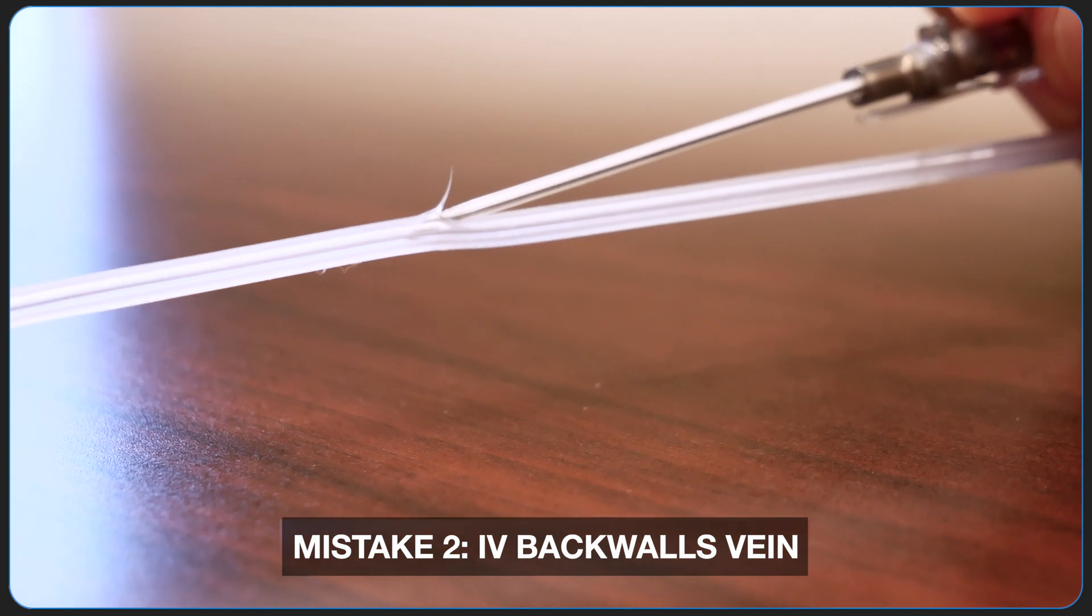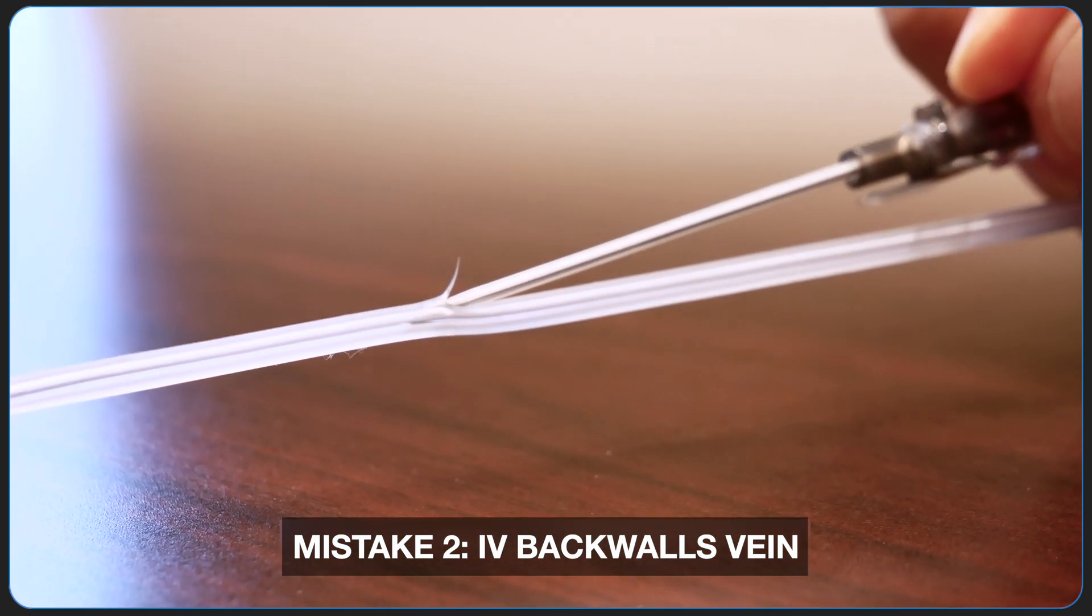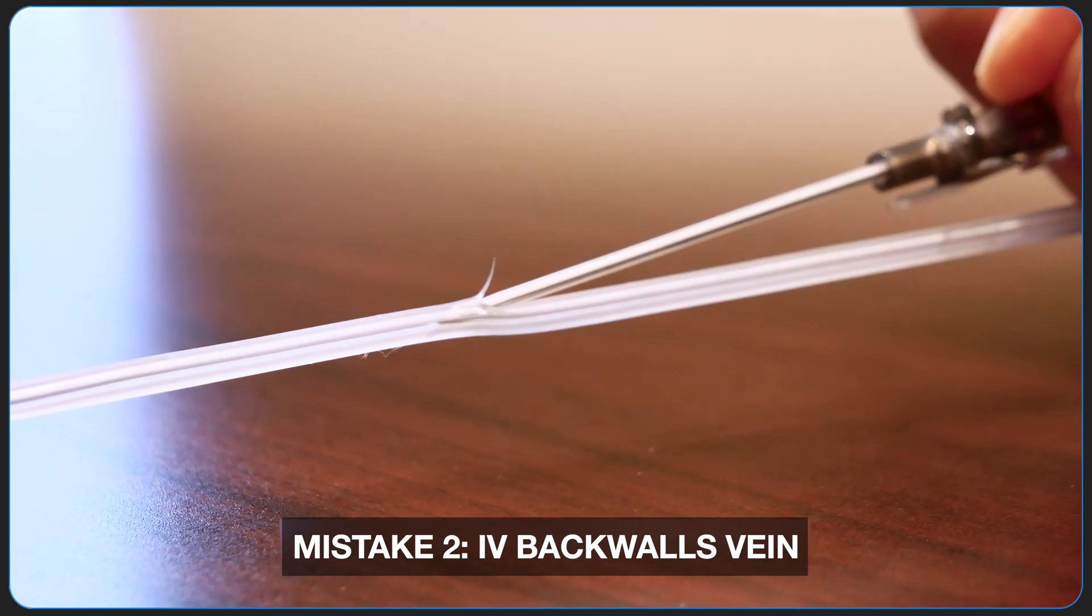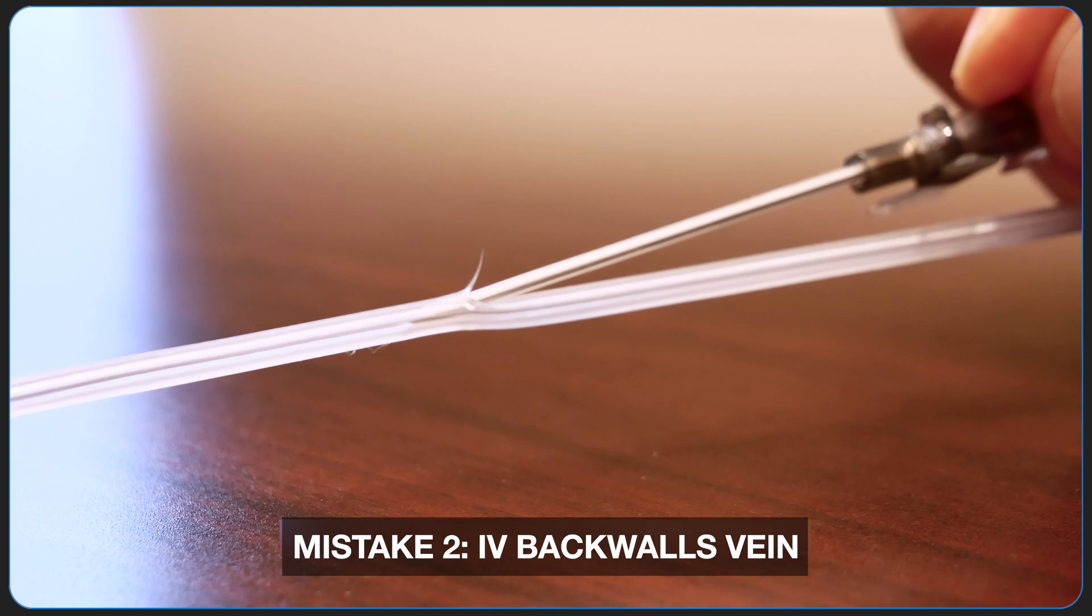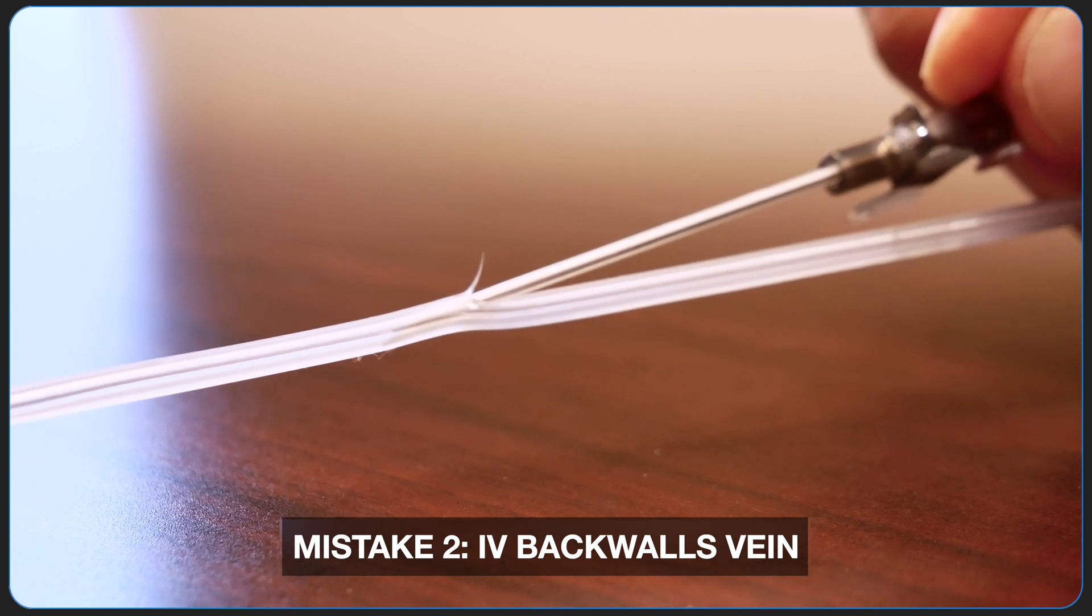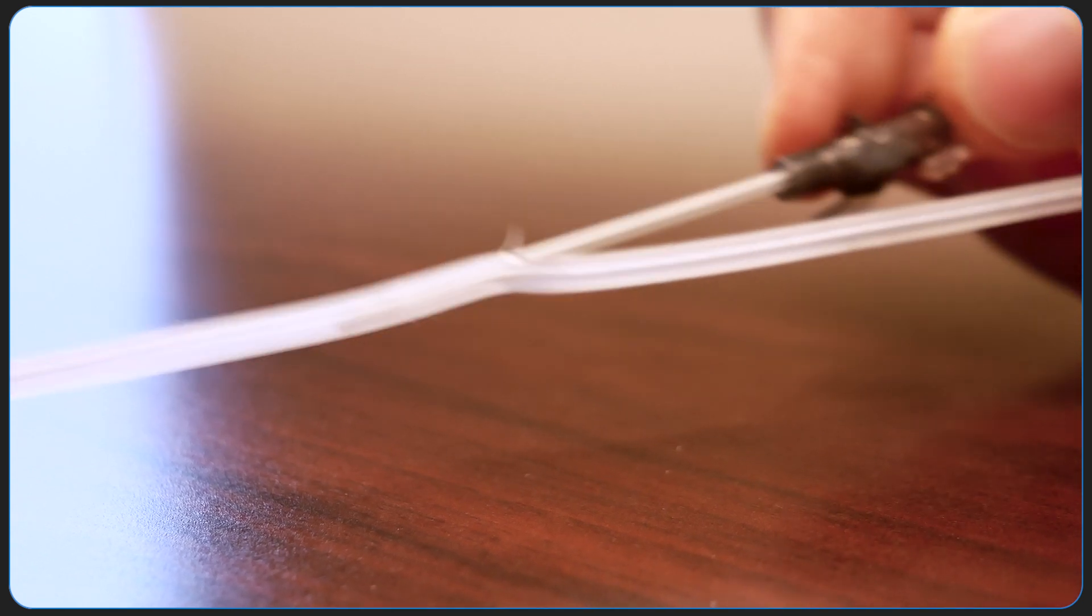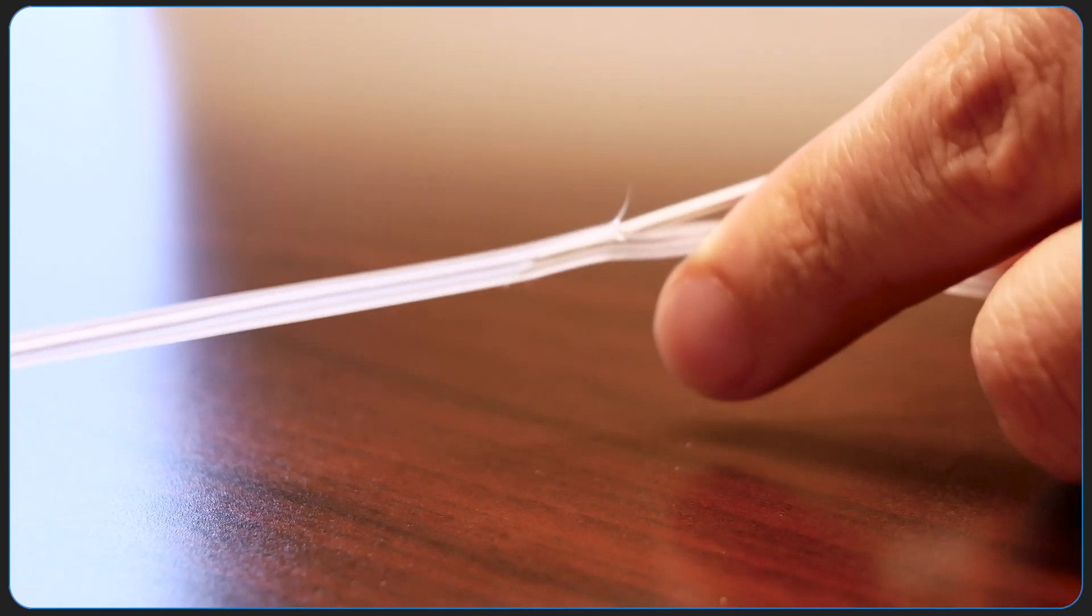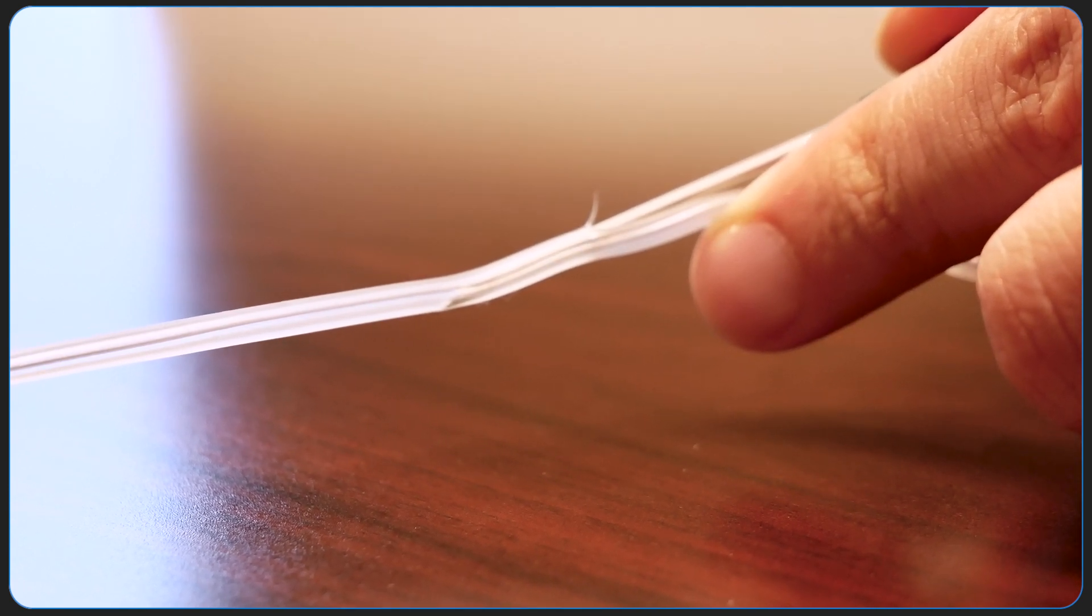Mistake two is backwalling. So remember how sharp this tip is and you only need a small angle. So look if I continue with the same angle even though it's maybe five, ten degrees at most, probably less in that direction, I'm going to start skimming the back of the vein and you can see it starting to penetrate through right there.